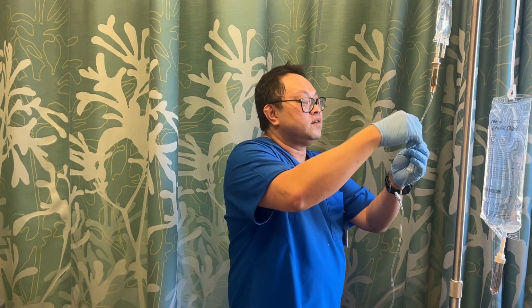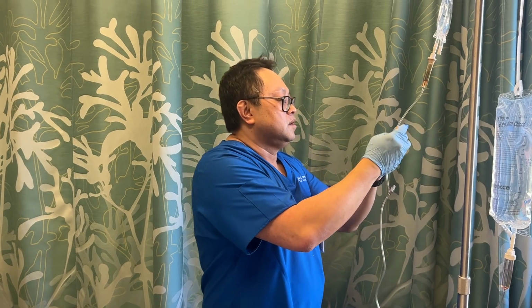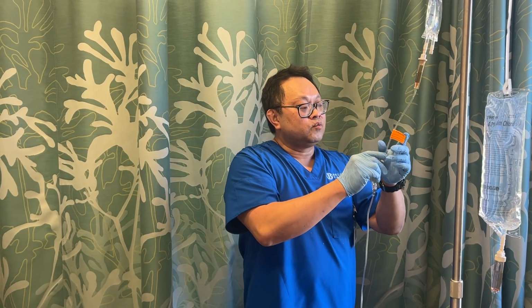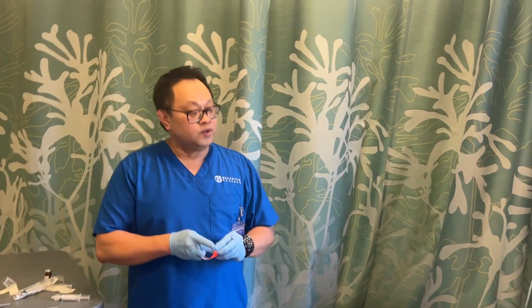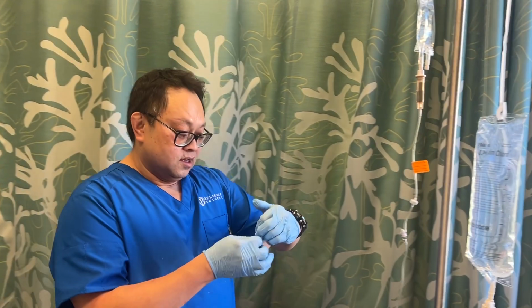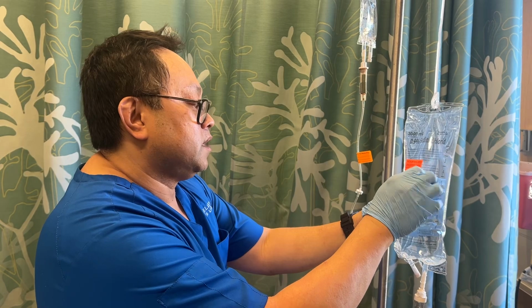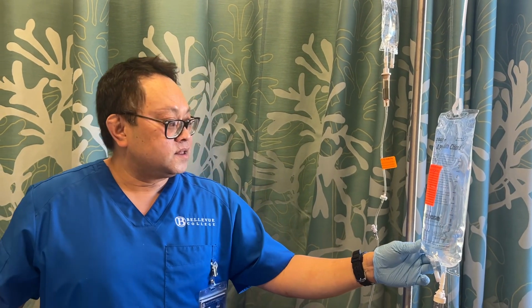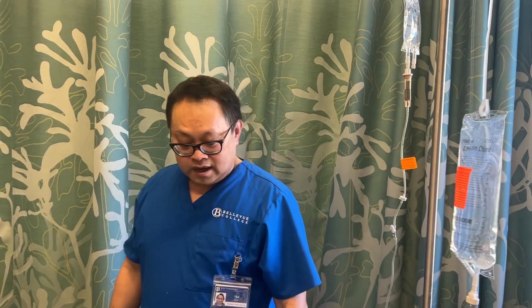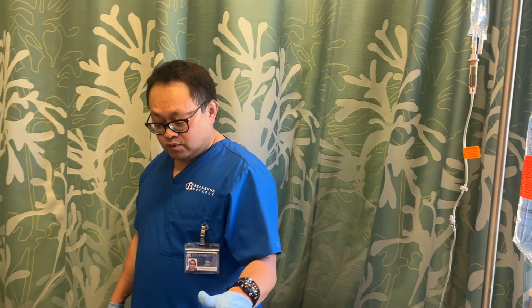put a tag on the tubing with my initials, the start date, and when to discard it, and it should be changed every 72 hours. Same thing with the medications, right? My initials, the expiration date, the medication, the dosage, the flow rate, the date, the time, and all that. Okay, and so I asked if the client needed anything.